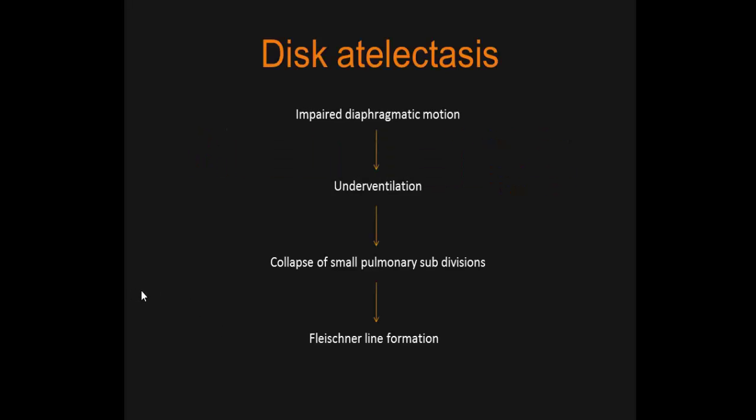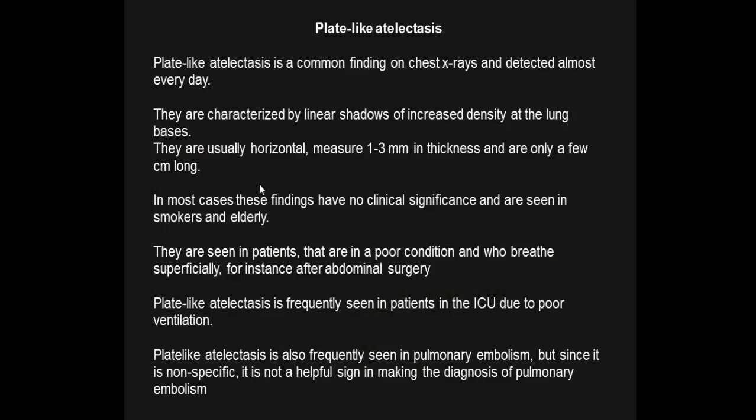Discoid or plate-like atelectasis: impaired diaphragmatic motion leads to underventilation, collapse of small pulmonary subdivisions, and Fleischner line formation. Examples show atypical linear transverse markings at the lower lung bases. Plate-like atelectasis is a common finding detected on X-ray almost every day, characterized by linear shadows of increased density at the lung bases.